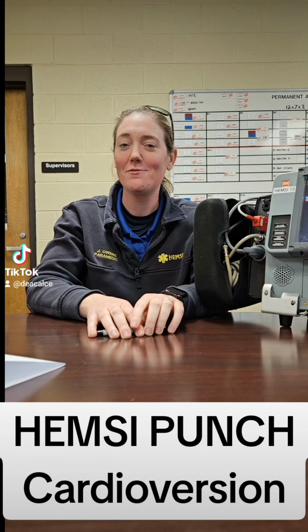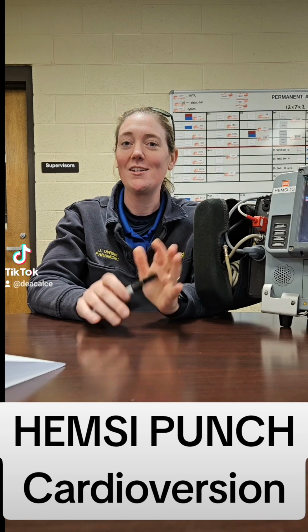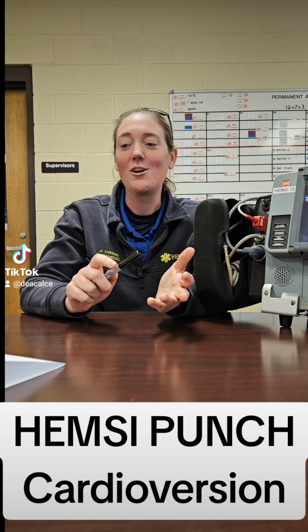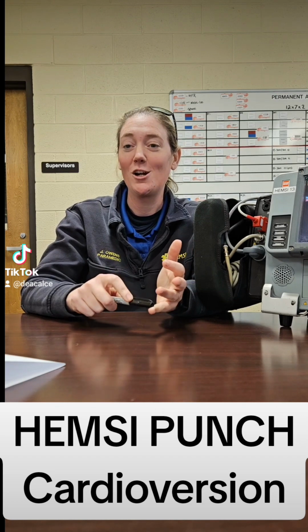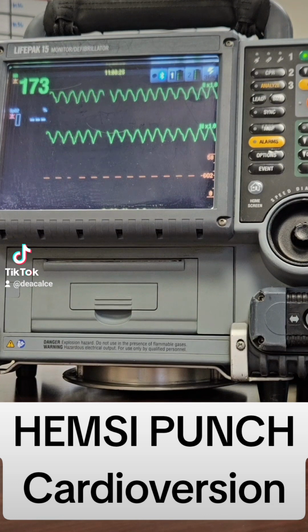This is Jordan. Today we're going to be talking about synchronized cardioversion in unstable patients and unstable tachycardia. So it's important to realize what unstable is fairly quickly so we can do those interventions. Our unstable, recognizable things right off the bat are going to be the profound hypotension, recurrent syncope, unresponsiveness. So before we get into the specifics, we're going to show you how it's done.